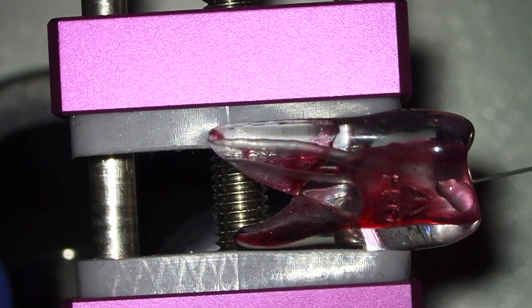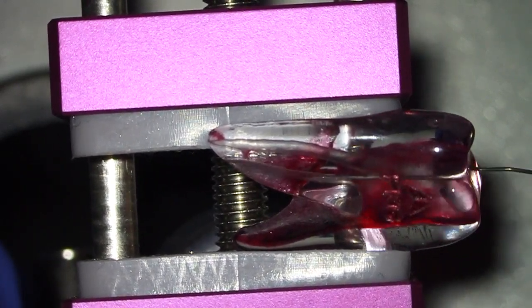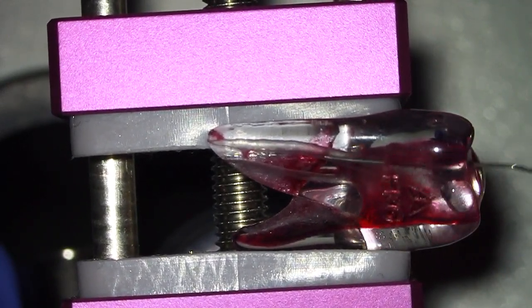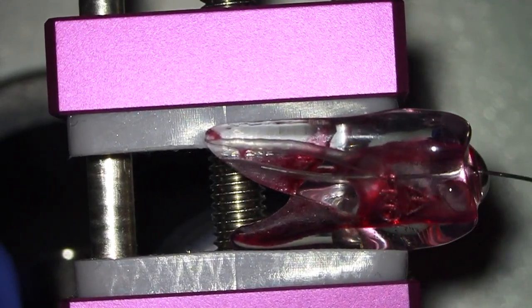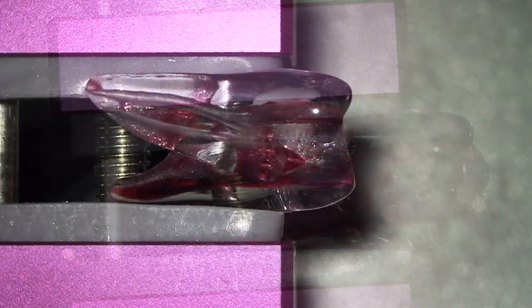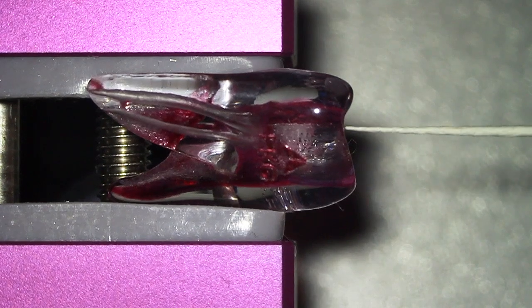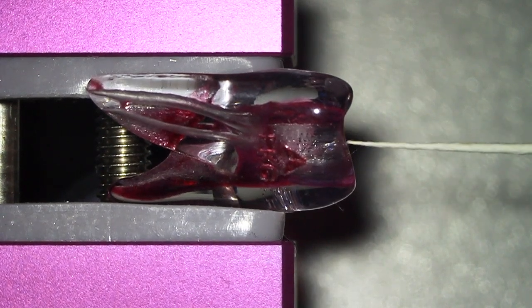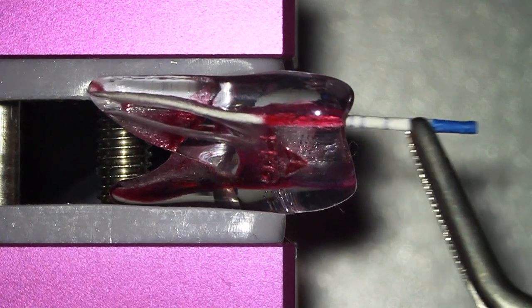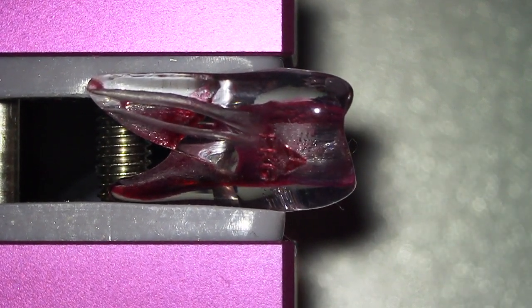Now we can proceed to the final rinse. When the shaping and cleaning are done, we can dry the root canal system with paper points. The XP Endo Rise sequence enables shaping of a canal to a desired size of ISO 30, 4% taper.